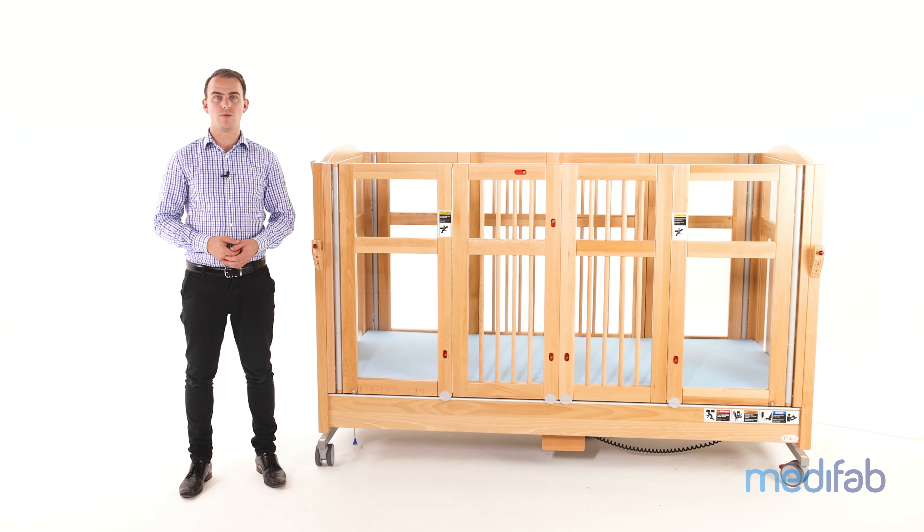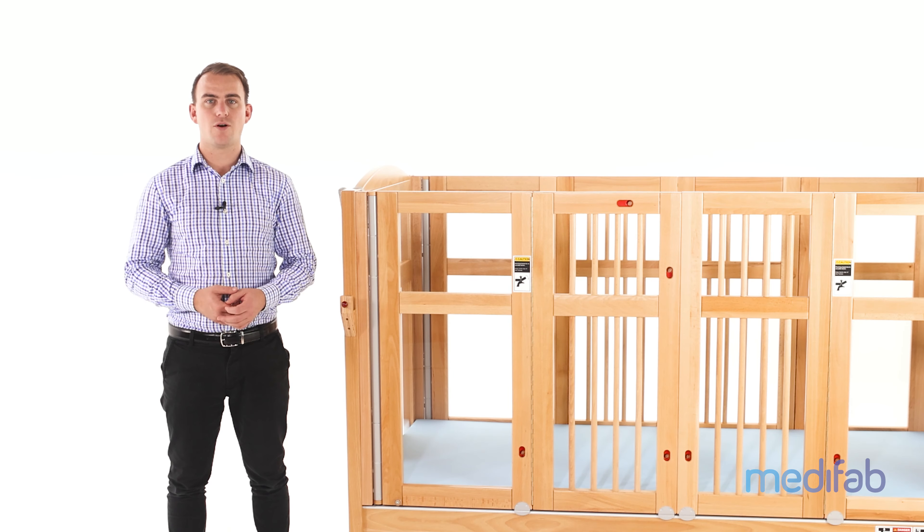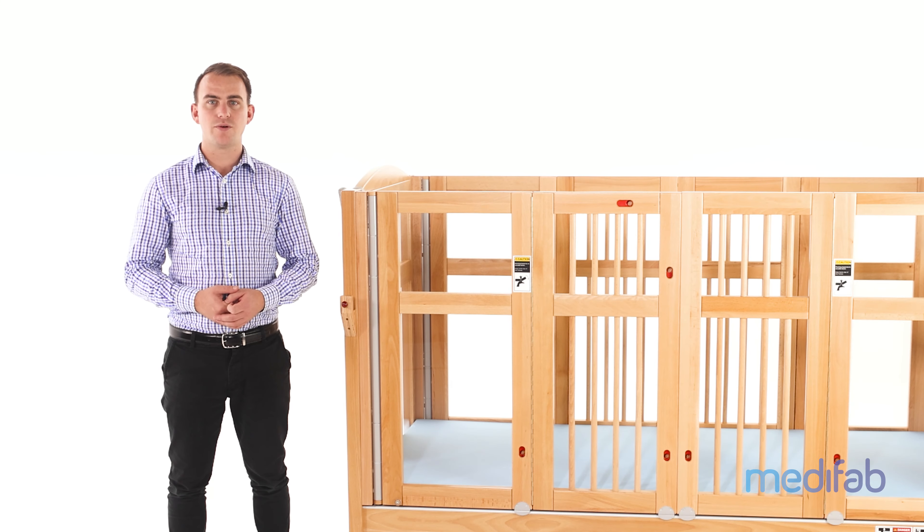Maintenance is very minimal on the Genie bed. However, when required, repairs must be performed by a trained technician. To ensure the safe operation of the bed, a visual inspection and a functional test once per year is required.